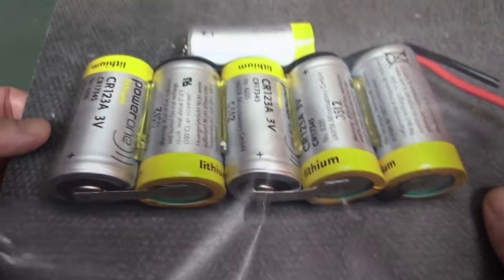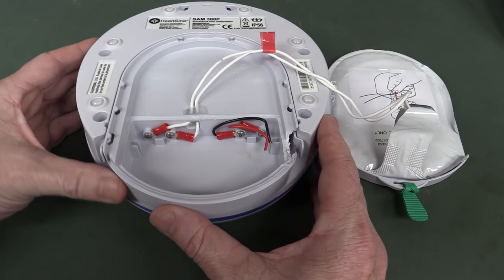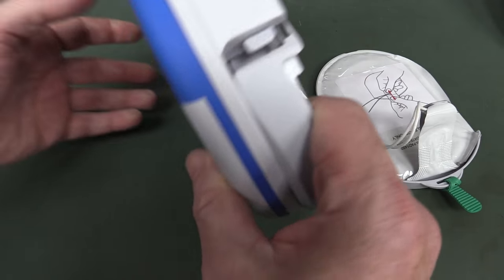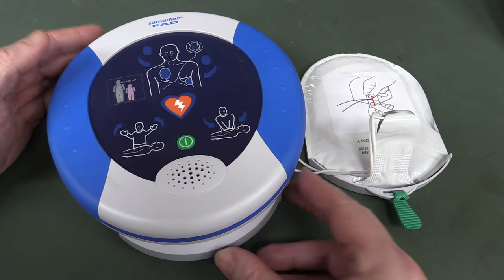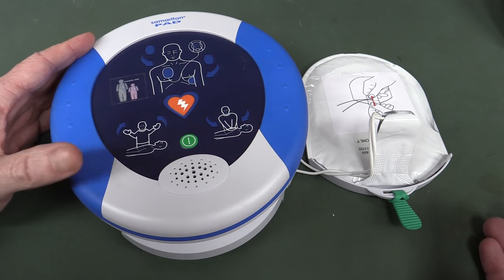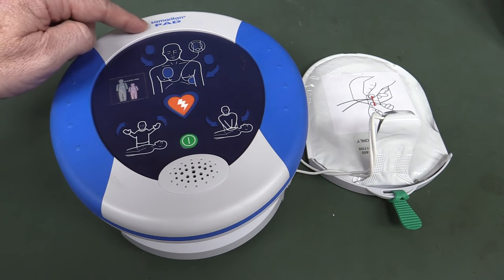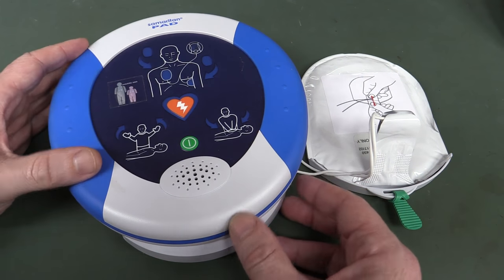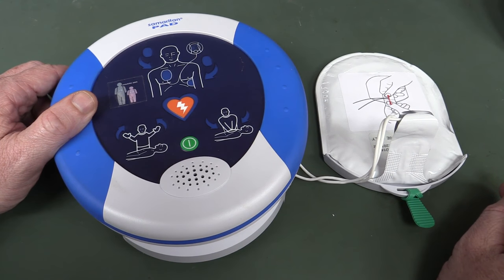Presumably they were shrink packaged or something like that, and they were sitting inside here. It's basically a single use type device — these are primary type things. This is actually one of these public access devices where you might leave them in a public location in a building or some other area. And if somebody's having a heart attack, so goes the theory — Joe Average, hence the name the Samaritan — a good Samaritan comes up and uses this thing to hopefully attach to somebody having a heart attack.